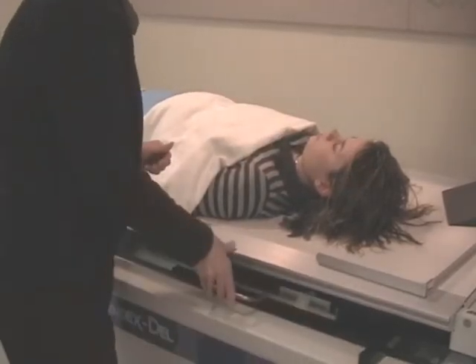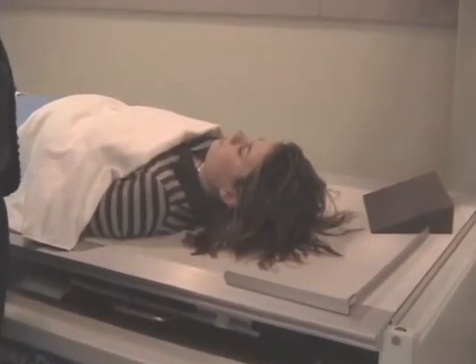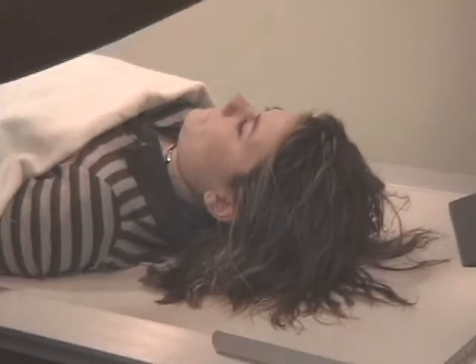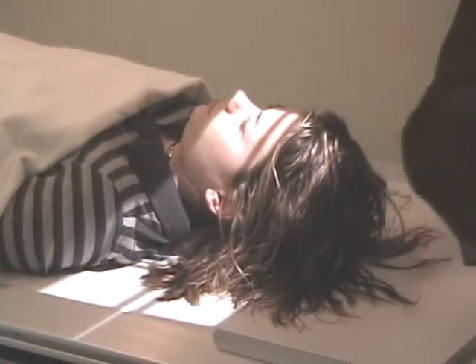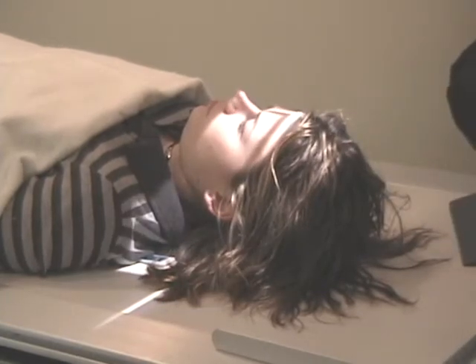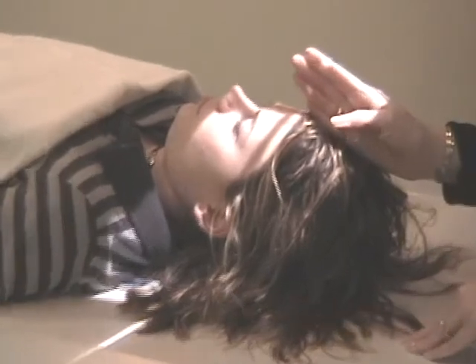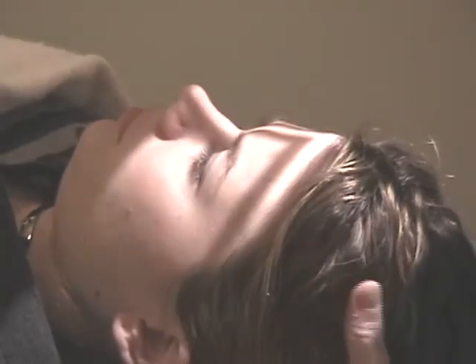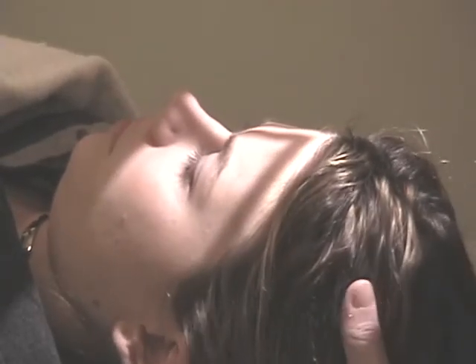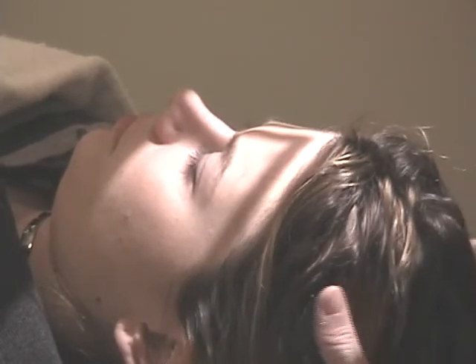Okay. I'm going to focus on the MSP now. Again, it should be centered and it should be vertical. So I need to realign myself. This is what you would do as a tech. Make sure your tube goes back to the transverse center. And the MSP is to the center of the film. And again, I'm looking at the canthus of the eye, the outer canthus, to the lateral aspect, making sure that she is not rotated. And I do want her straight on the table or else it will be tilted.